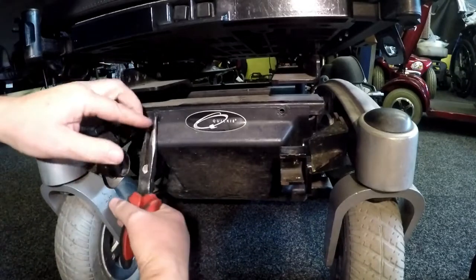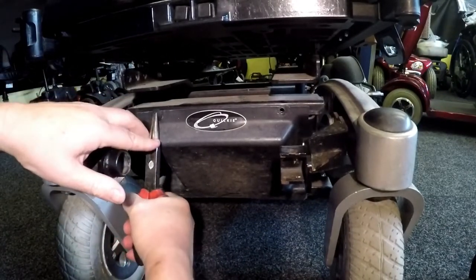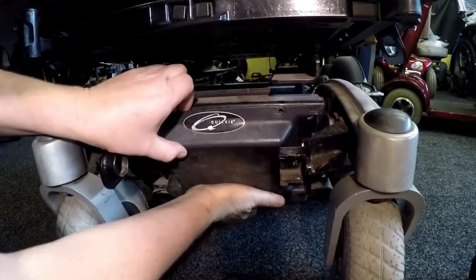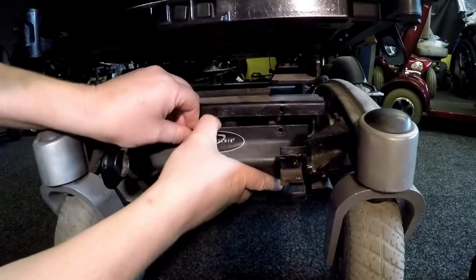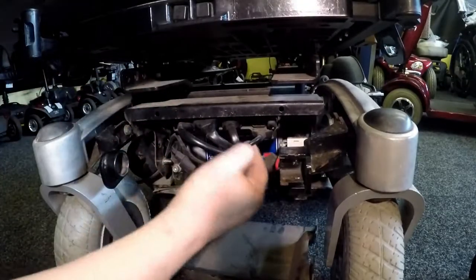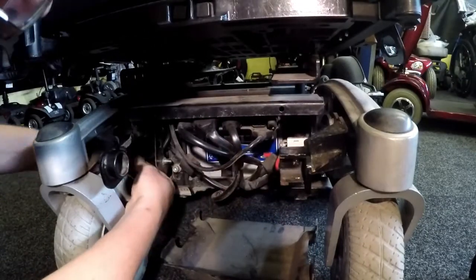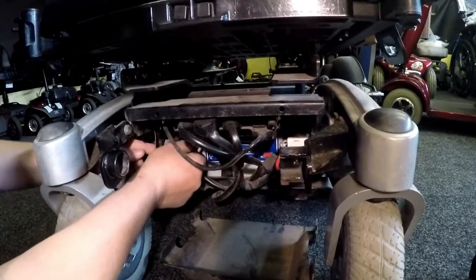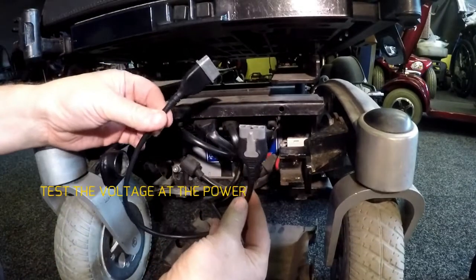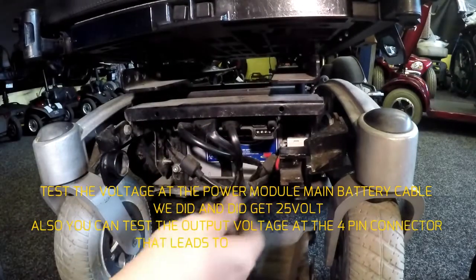So let me try this side. Let's see if this one comes out. There you go. Right, let's take this one off. There you go. So you've got the power module underneath here. This is your short extension here. I happen to have a new extension here, so I'll pull that out and stick a new one in.